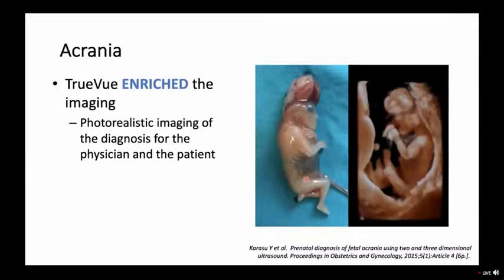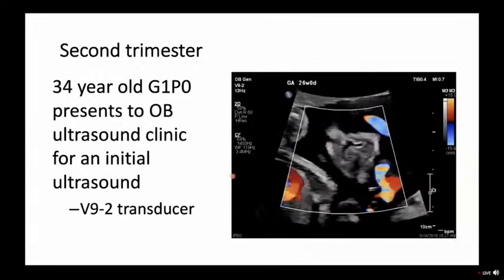And because of our 2D imaging, our movement to transvaginal ultrasound, and our use of 3D to show the patient her actual fetus, her actual baby, she's able to make an informed decision about what she wants to do with that pregnancy. So please feel free to use and move to vaginal ultrasound and turn on the 3D, because it really does help the patient understand the diagnosis.